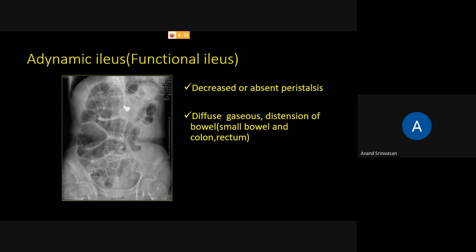Okay, for any X-ray, it has to be correlated with your clinical examination. So with your history taking and clinical examination, you need to correlate it to come to a diagnosis. Just by looking at an X-ray, it is very difficult to come to a conclusion.